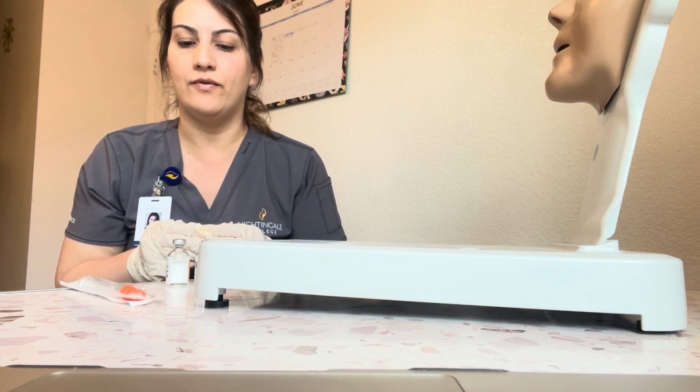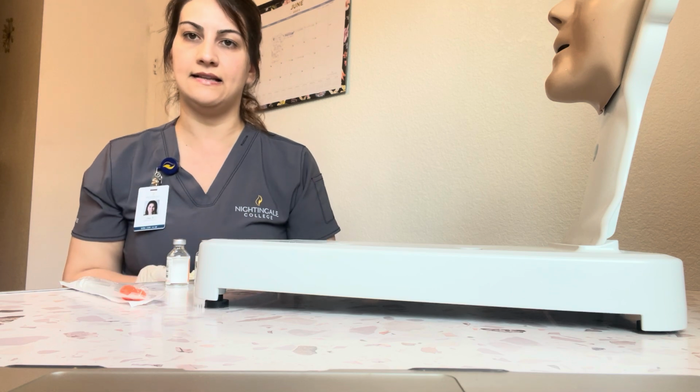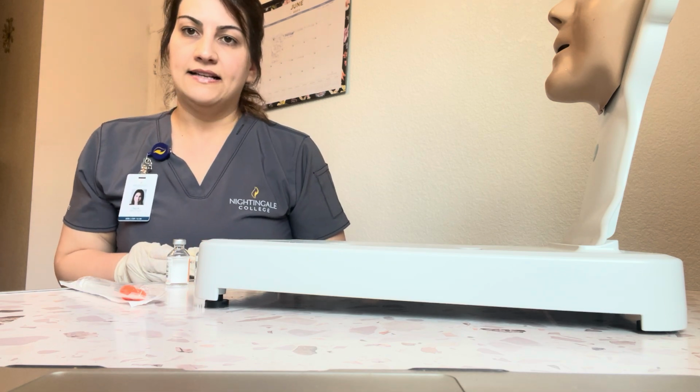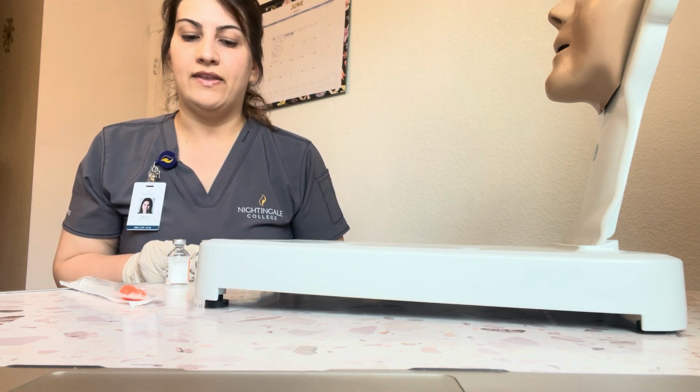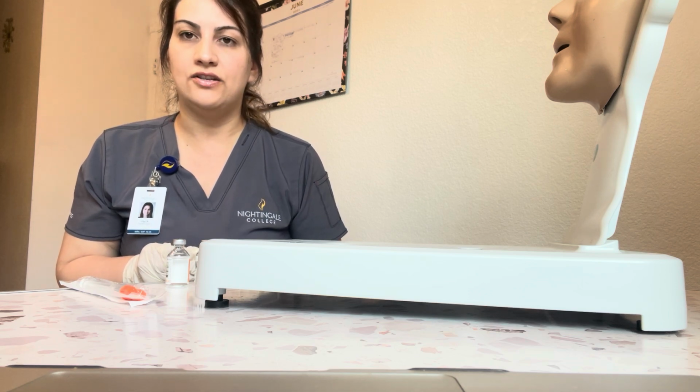And then next I'm going to draw up the air of the 4 units of regular, and I'm going to inject that air, and then I'm going to tip it over, and I'm going to draw up the 4 units of the insulin. Next, after that, I'm going to draw up the 8 units of the NPH, which is going to equalize to 12 units of insulin.